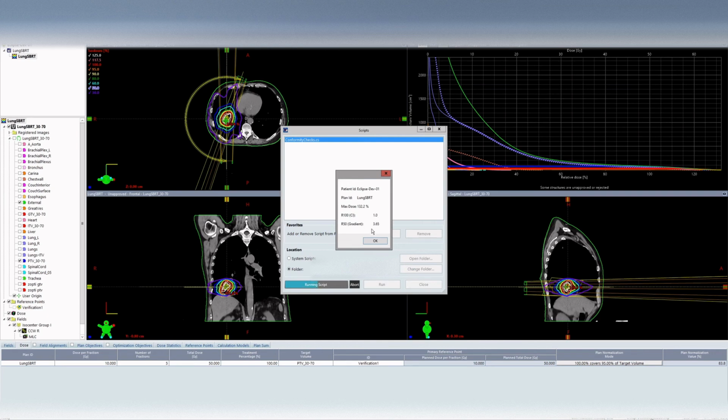So now we can see, earlier, if you were watching earlier, we had done some rough calculation. It was like 3.65 something. So there you go. So now what you would need to do is, we haven't done that yet. We'll do that next, and we'll do it in sort of a smart way so that we can use it in the future.